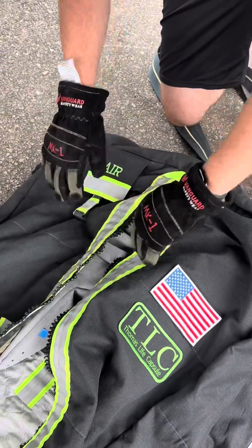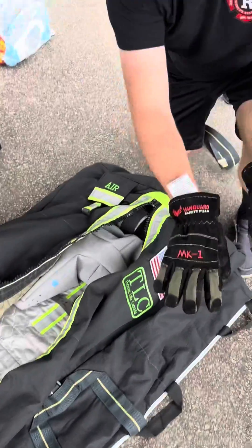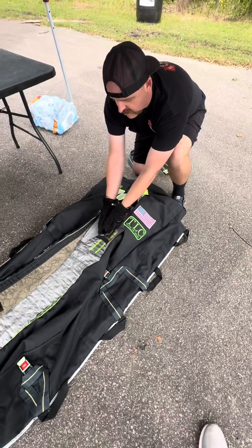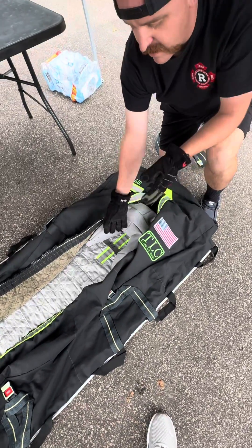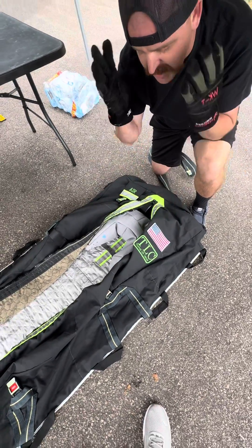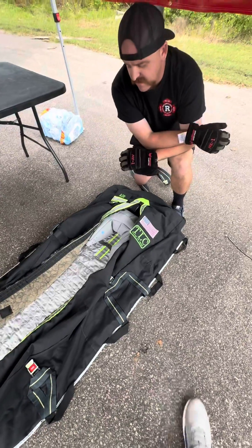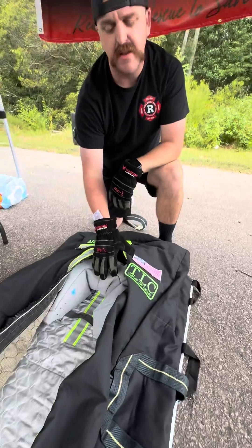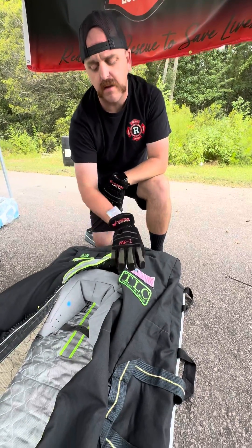Air is flowing. Right now you're going to be packaging — getting your person, your victim, in here. You're going to get them set up in there, and then the head chamber is going to essentially conform to protect their head. It takes about 20 seconds to get this completely full and charged, but we can be putting them in there sooner than that.